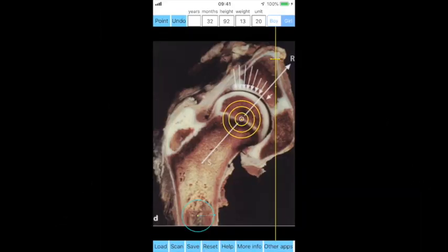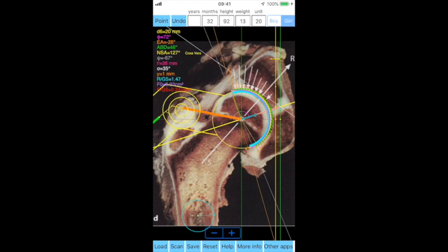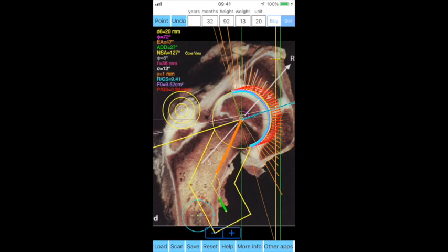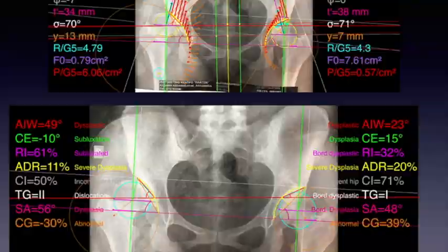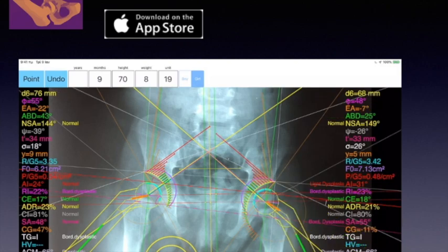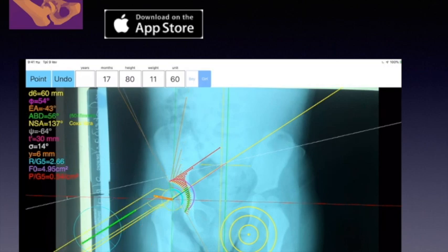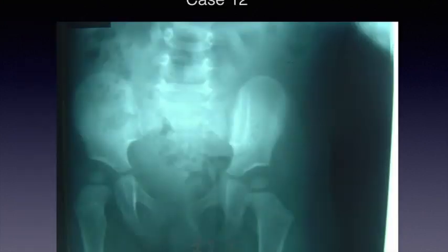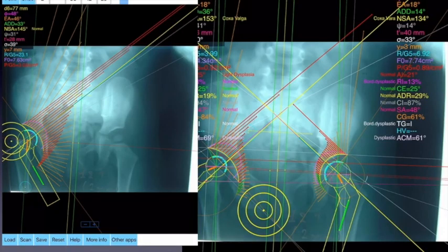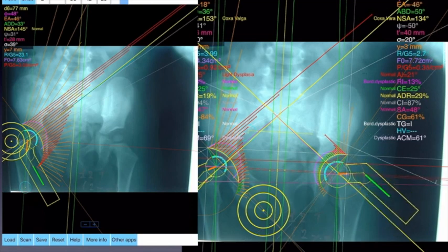An established method of treatment of developmental dysplasia of the hip, DDH, is the use of an abduction splint, also in walking children. To achieve a favorable outcome in treatment of DDH, the abduction splint has to place the leg in such abduction, thus allowing concentric distribution of pressure of the femoral head inside the dysplastic acetabulum and inducing the remodeling of the acetabulum towards normal. The surgeon is usually faced with the dilemma of how much abduction is necessary to induce the acetabulum modeling. The degree of abduction of the splint is usually chosen according to the surgeon's experience by surmising which is the optimal biomechanical position of the leg in static X-rays.